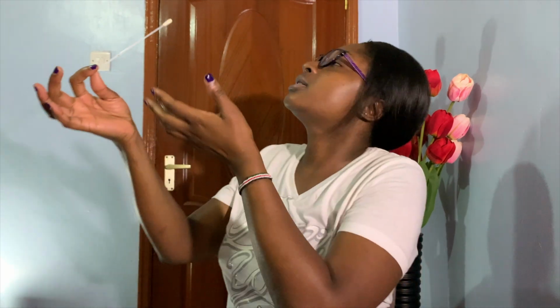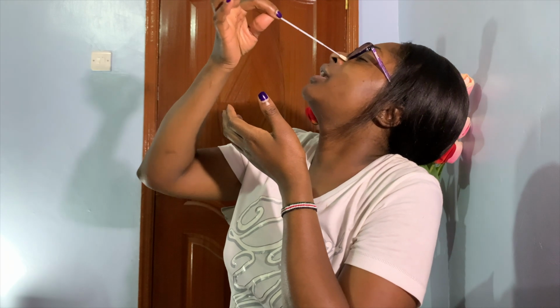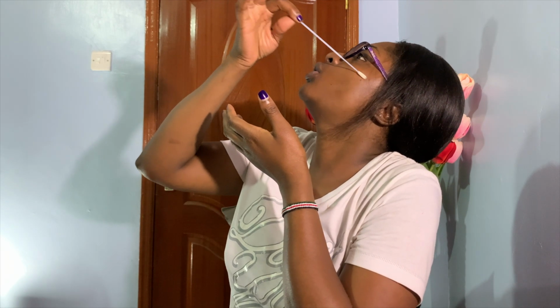So basically what is done, you have to be at some sort of an angle, and this will be pushed deep inside your nose. So I will do the very first step of taking the nasal swab, and then I'll explain everything after that.